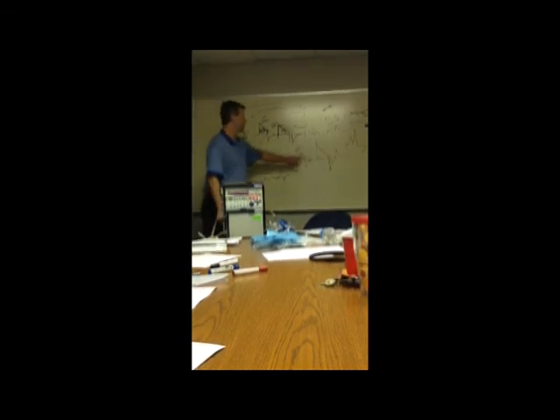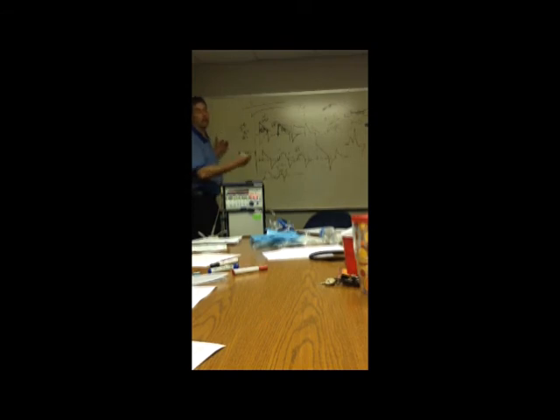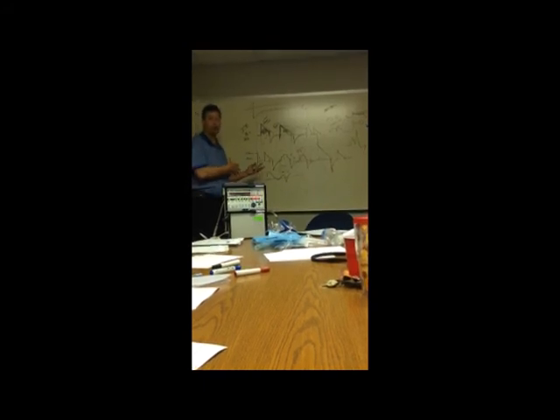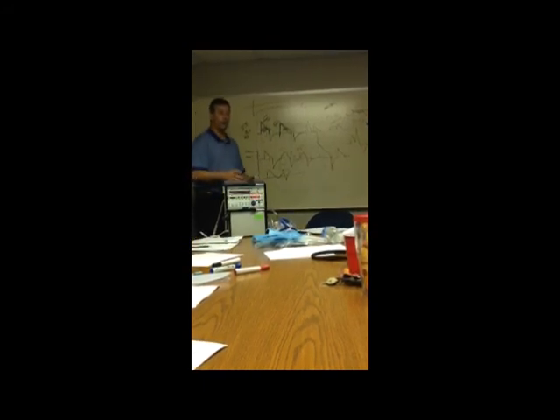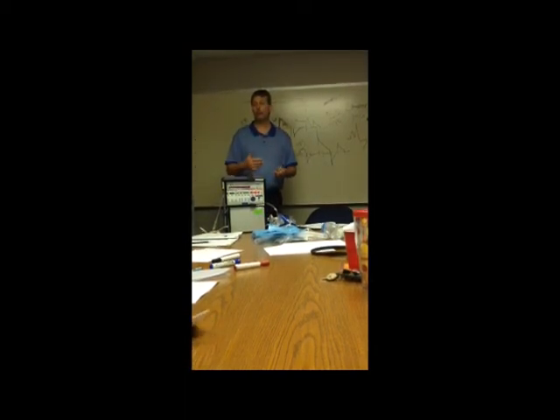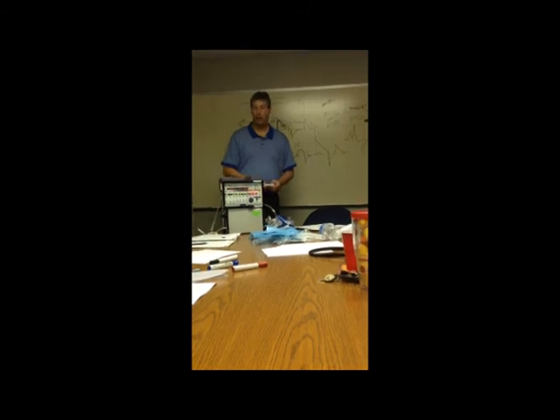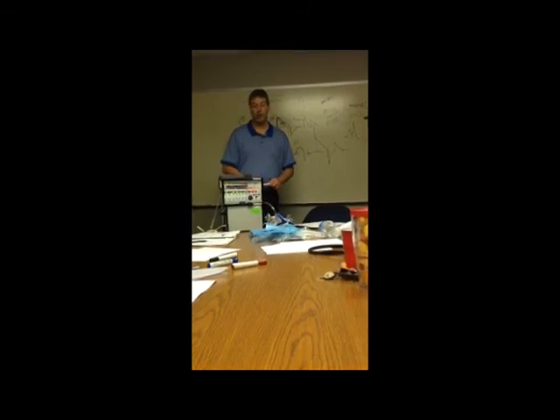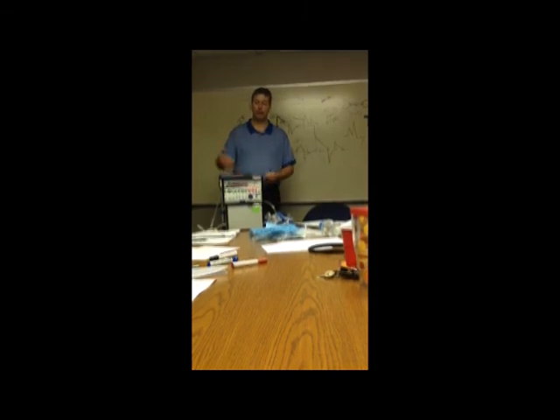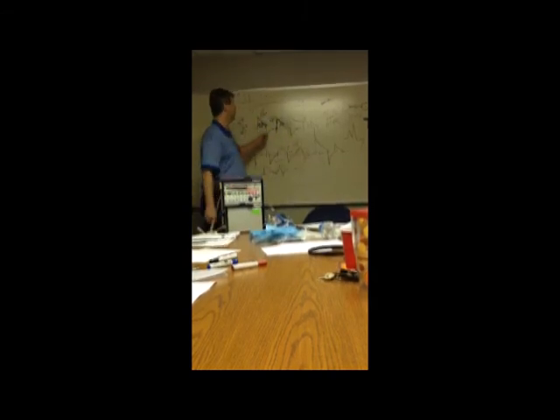All right, so now you know what pressure assist control does. It's the pressure breath in this pattern. You know what the volume in this pattern is. It's two of them. You know the IMV with volume. Now you know IMV where these breaths are pressure-based. That's the fourth mode. The fifth is the spontaneous, which is mimicking CPAP on a vent. It's CPAP with pressure support, which y'all shouldn't use. If you know those modes and pressure breath combinations, you'll never get a patient who's on anything different. You may get somebody with bi-level, but you'll have a therapist and a machine that does it with you. But they're probably going for ECMO, right?